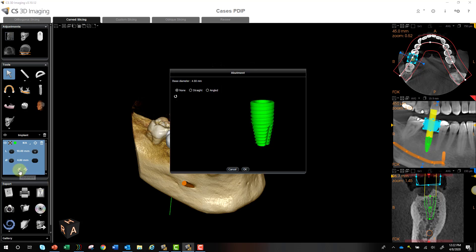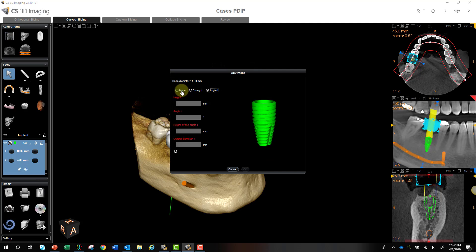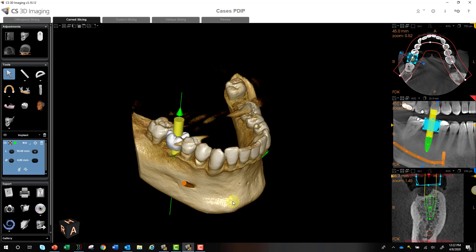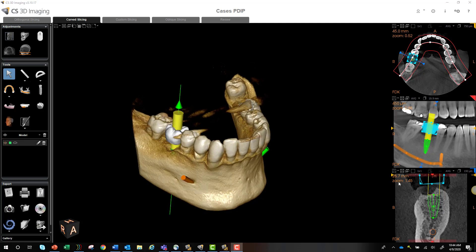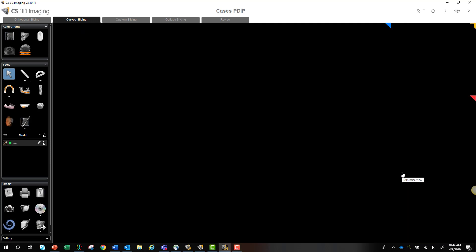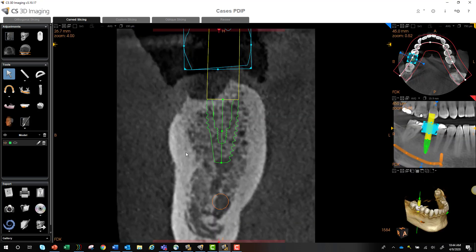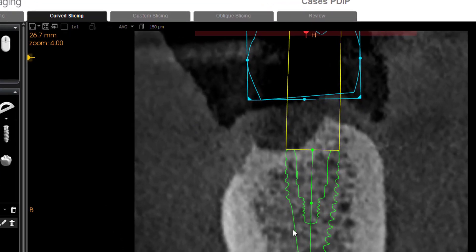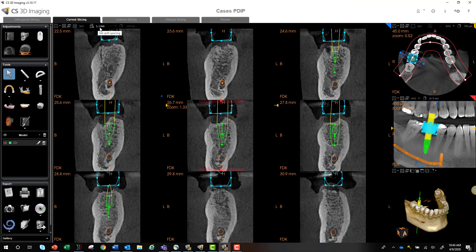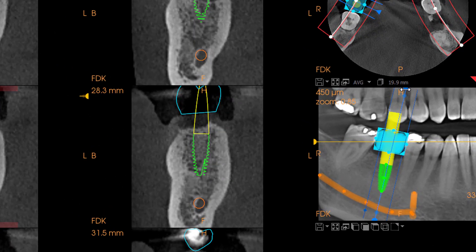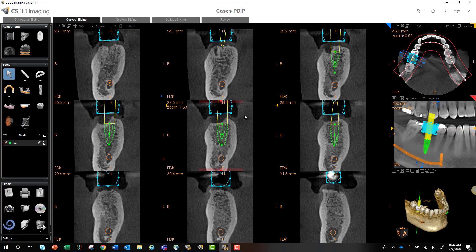There's also an icon to add an abutment — either straight or angled — and you can play around with those features to your liking. You can also visualize implant placement better by switching your cross-sectional view from a single 150-micron slice to a 3x3 with 1.1 millimeter increments, giving you roughly 10 millimeters of edentulous space in one single view.